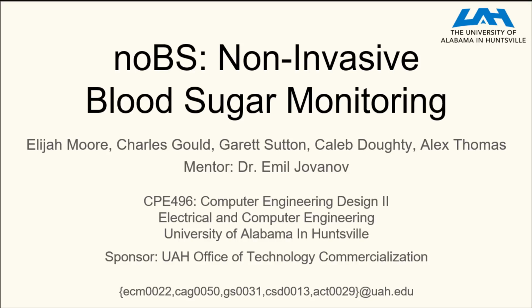Chronic glycemic disorders, like diabetes and hypoglycemia, require regular monitoring of blood glucose levels. From fingersticks to interstitial monitors, all current market solutions utilize invasive or else semi-invasive methods. This means that those living with chronic glycemic disorders must regularly deal with the pain of needles and the waste and expense of disposable monitoring supplies. At present, there is no way to measure blood glucose without invasive methods.